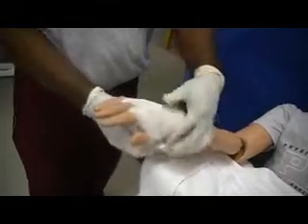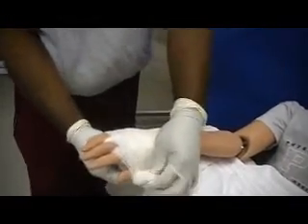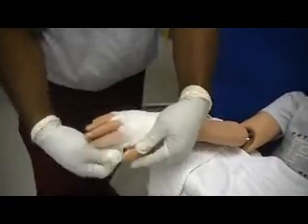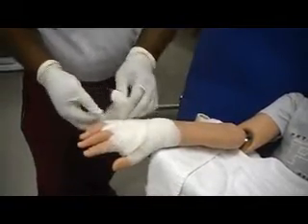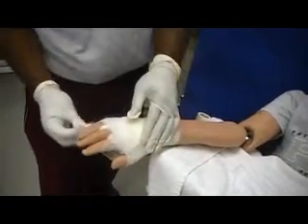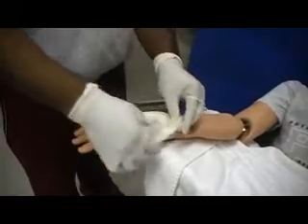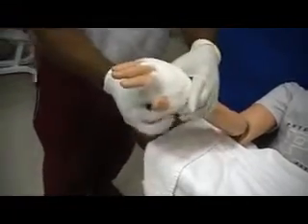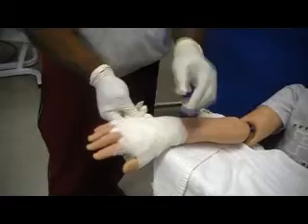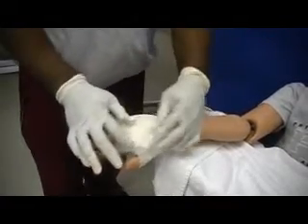All right? So again, making sure that any contamination that could possibly occur cannot, because an inch around the borders of the 4x4s will be completely covered all the way around that area, and that area will not become further infected.